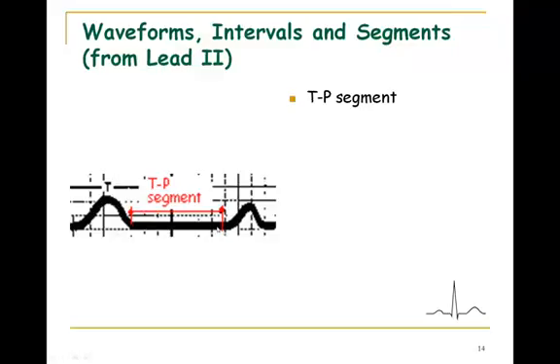It's just like we talked about with the ST segment. It should be isoelectric, but you're allowed a little variance. It could be a millimeter above from what you compare to the J point, or a millimeter below, which again corresponds to 0.1 millivolts above or below the J point. If it's deflected more than that, or if it's elevated or depressed, there is something wrong. Again, same thing as the examples when I told you about the ST segment.